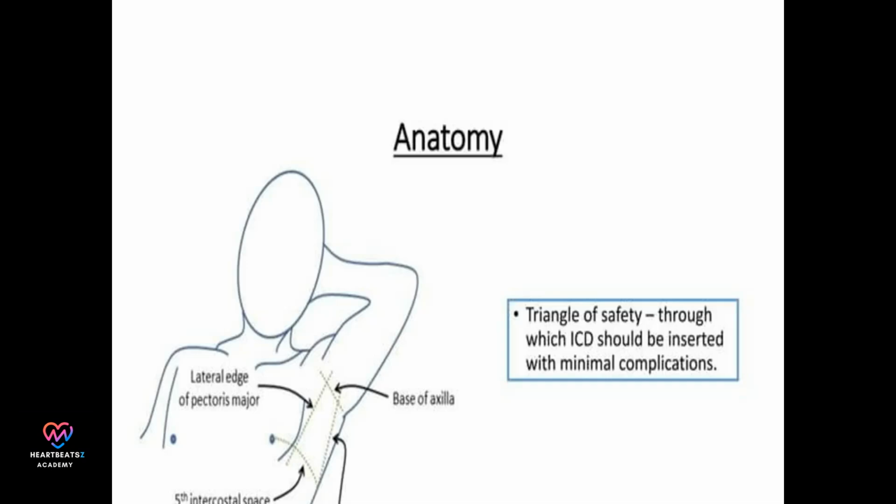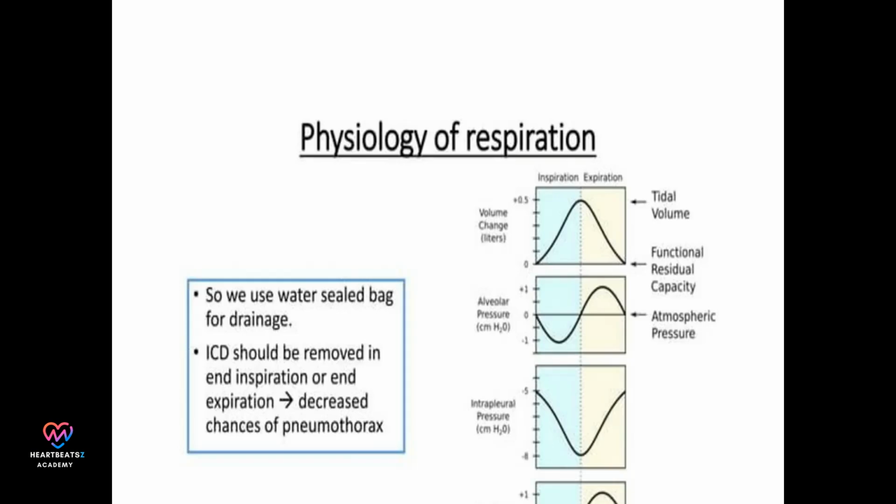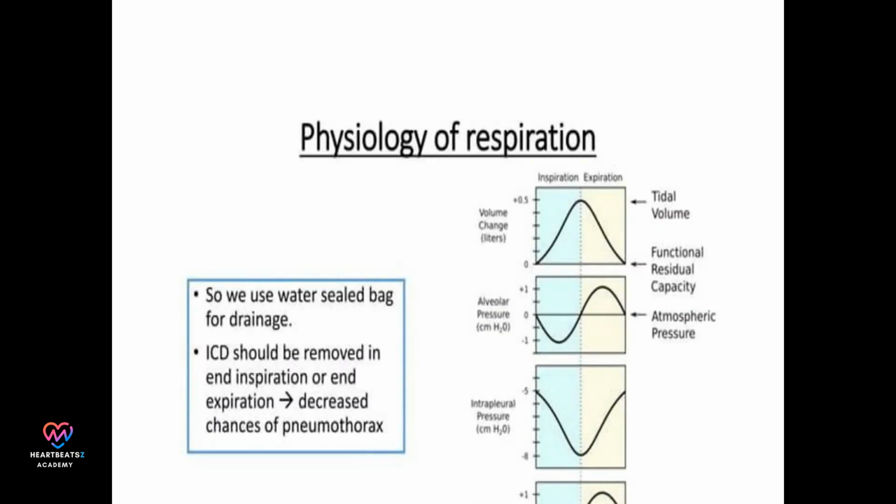The triangle of safety for ICD insertion includes the lateral edge of pectoralis major, base of axilla, and fifth intercostal space. The physiology of respiration involves negative pressure in pleural spaces. ICD helps when there's a breach in the pleural barrier. Water-sealed bags are used for drainage.